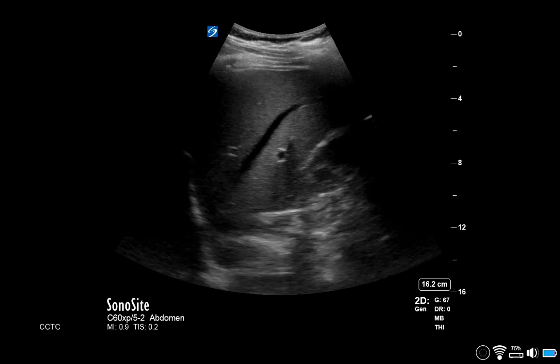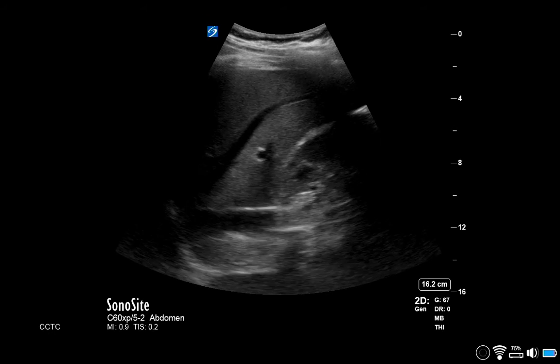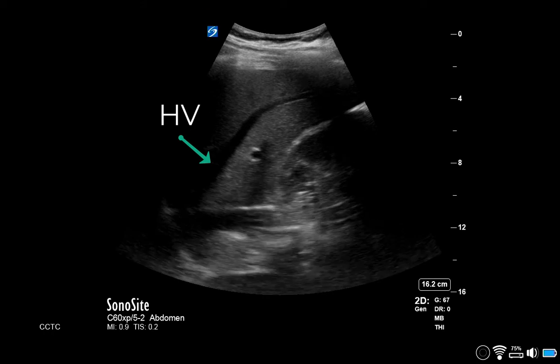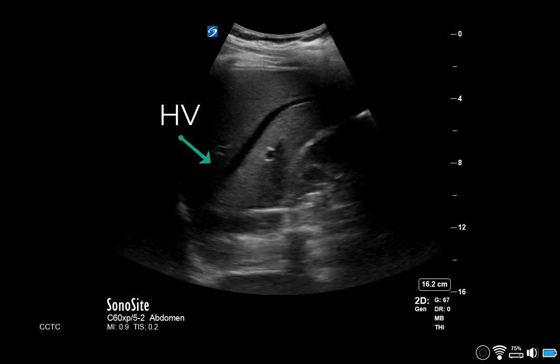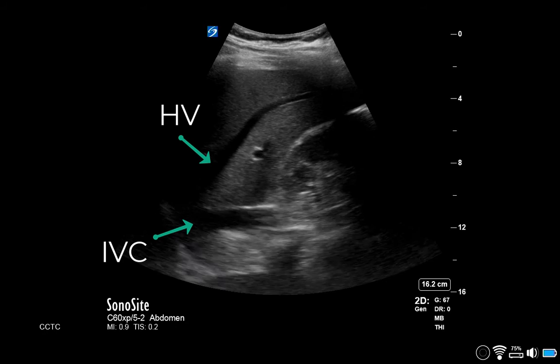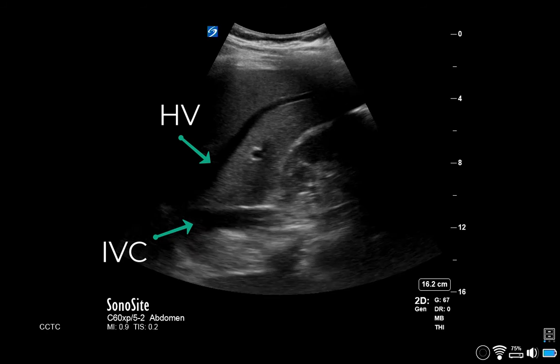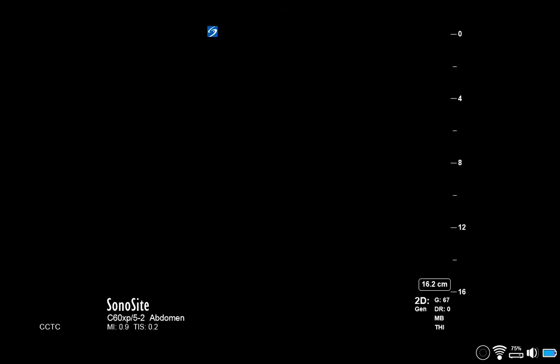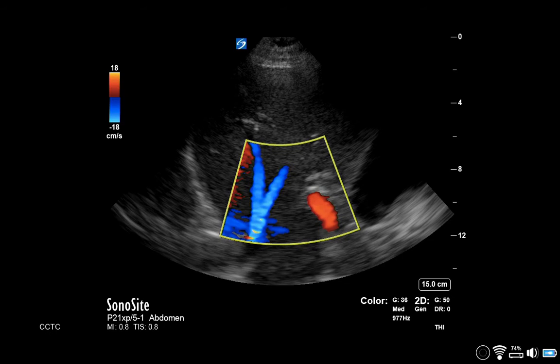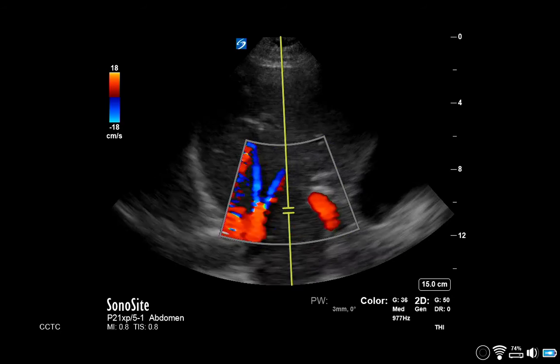Begin in the right upper quadrant and identify the hepatic vein as it drains into the IVC. This can also be done in the subcostal region. Enable color Doppler and place the box over the hepatic vein. This also helps to identify it, as the flow is predominantly away from the probe.